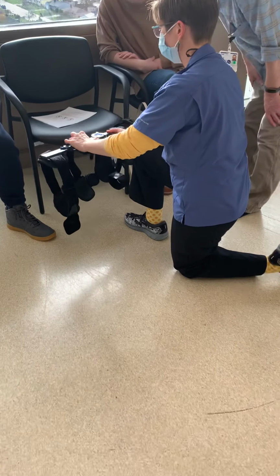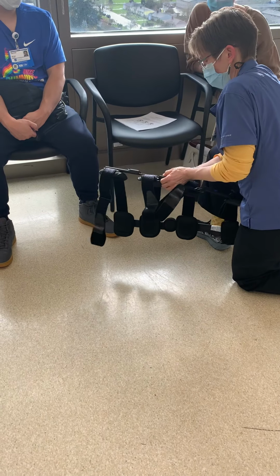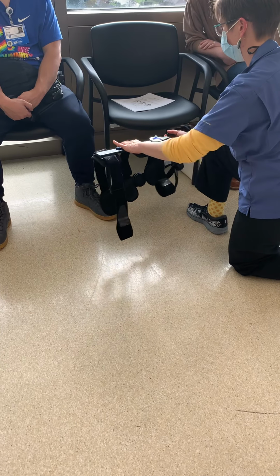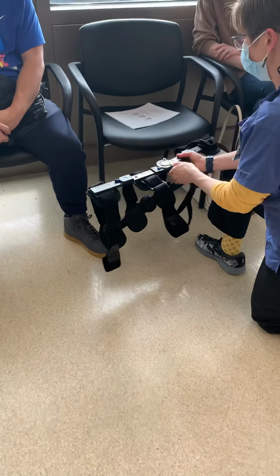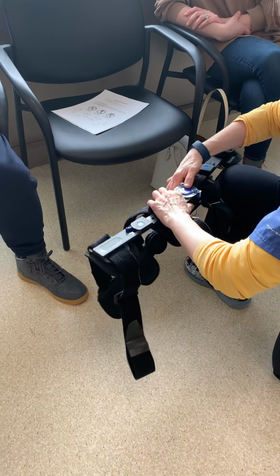But once you have it in the setting that you want, it shouldn't move after you're done with it. There you go. I usually hook that other switch back. So you see that's not going to go anywhere. If you have somebody that is supposed to allow some bending, then you would probably set it a little differently.